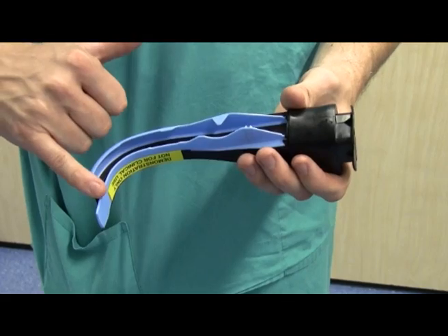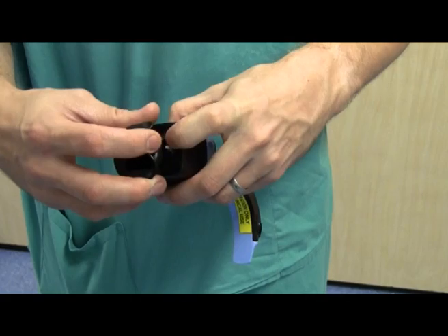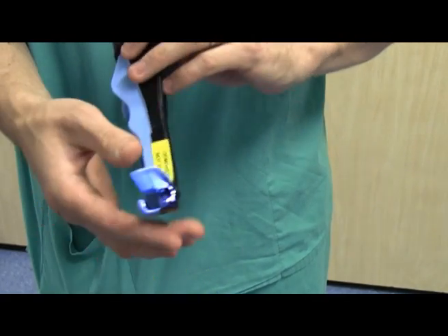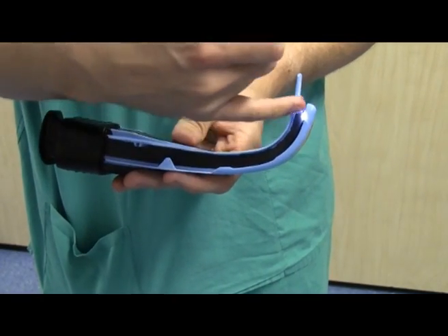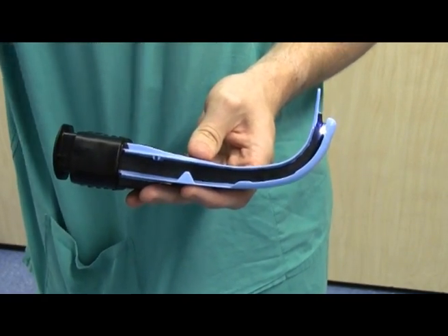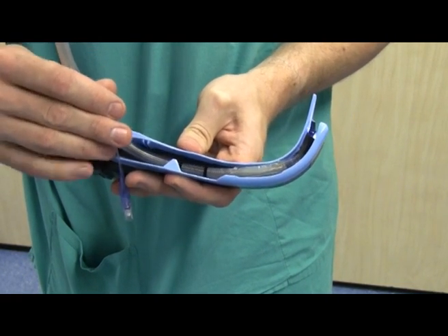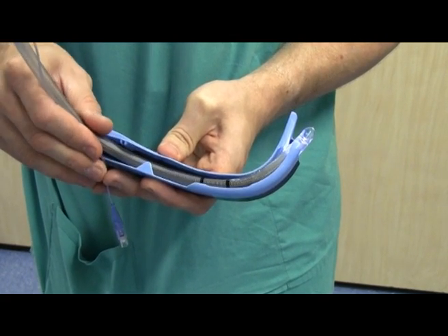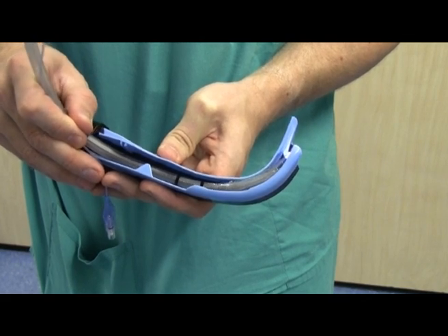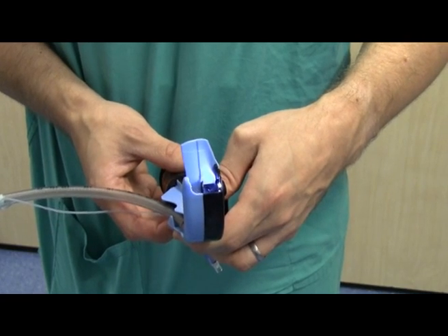The Airtrack laryngoscope is a single plastic unit — it consists of a blade, an eyepiece at the top, and an on switch, and if you look at the bottom that activates your light source. You'll notice there's a channel at the side into which you pre-load your endotracheal tube. It's important that the tube doesn't go beyond the tip, so pull it back so that you can just see it. And now you're ready to perform your intubation.